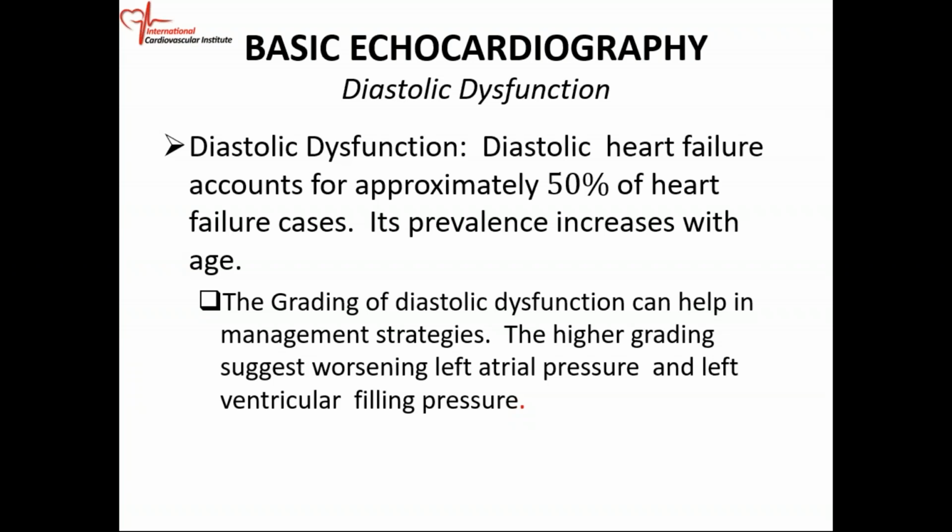So if we're talking about diastole, we're talking about the two diastolic components, your E prime and your A prime. We're more interested in the E prime. Other things that we're going to look at are your left atrial volume and your left atrial pressure. So those are the things that are going to determine diastolic function and hence dysfunction.